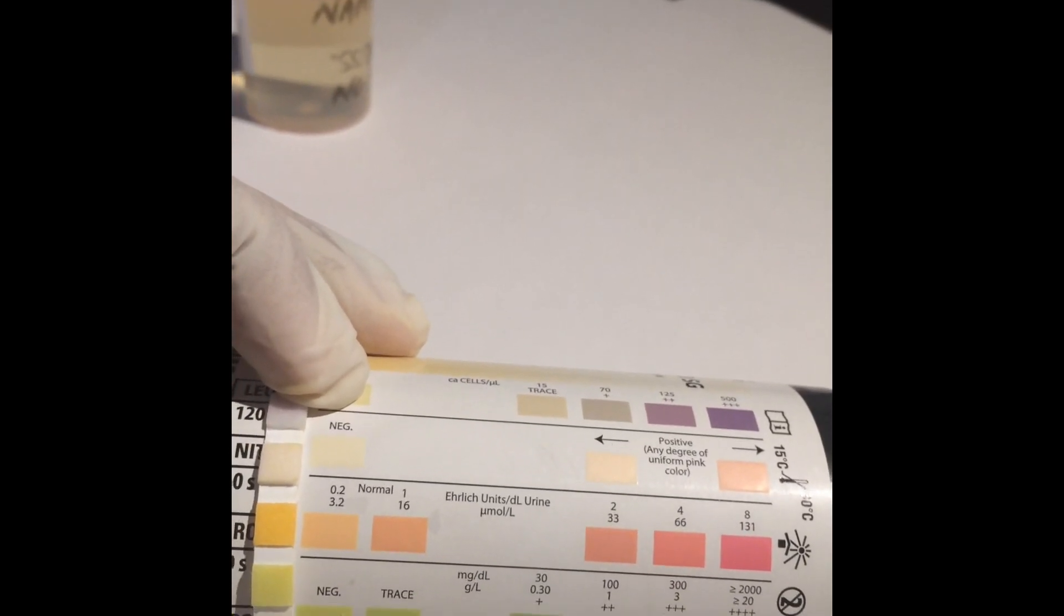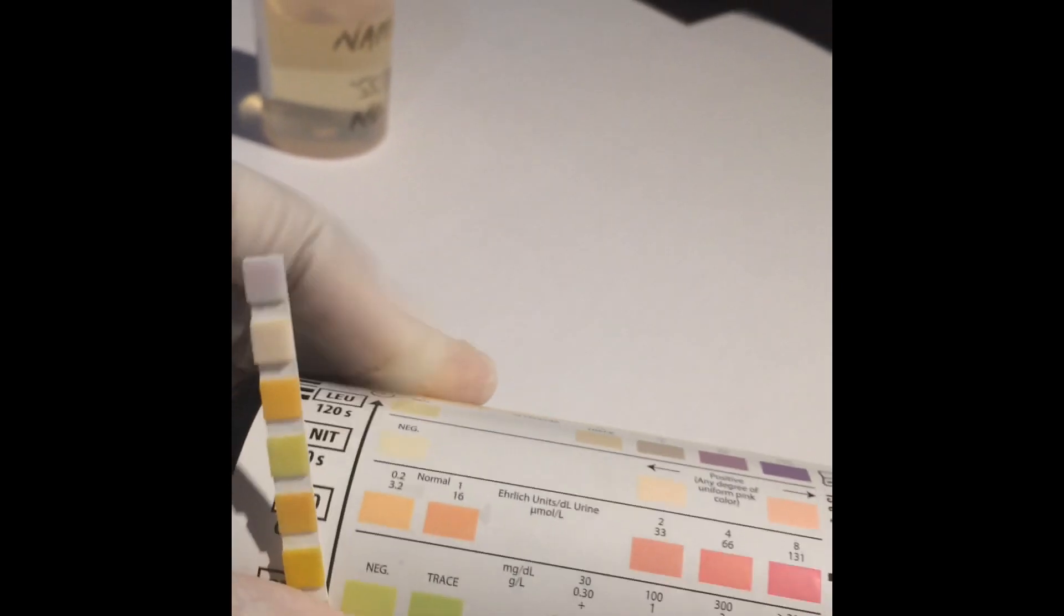Leukocytes, which is WBC, is purple. It looks like a plus one.